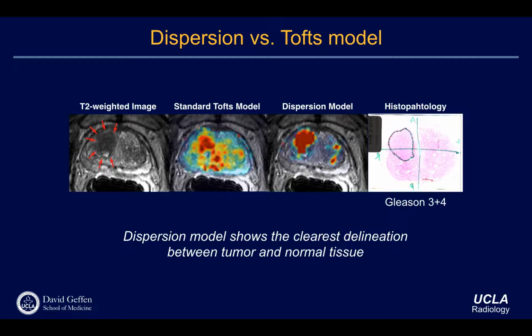So, if I understand correctly, you can use the K-trans factor to distinguish how aggressive a tumor is, and so you will compare different patients. But is it possible that a different patient has a different arterial function, just because our circulatory systems are different? Since it depends on the arterial function, which changes the K-trans, how can we compare the two of us for aggressiveness of the tumor?